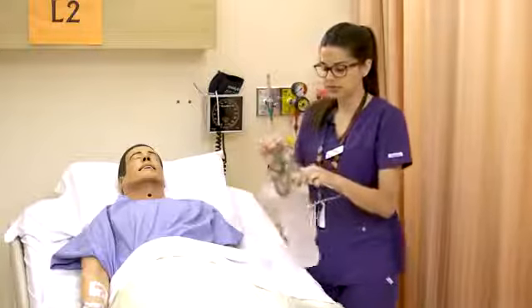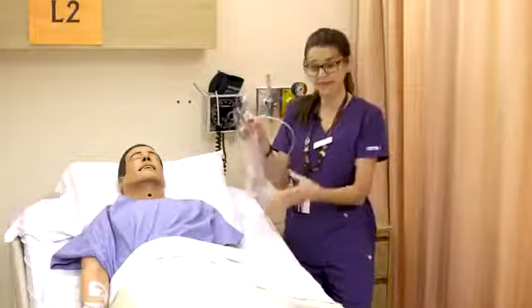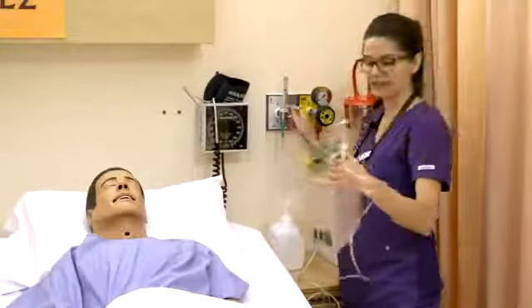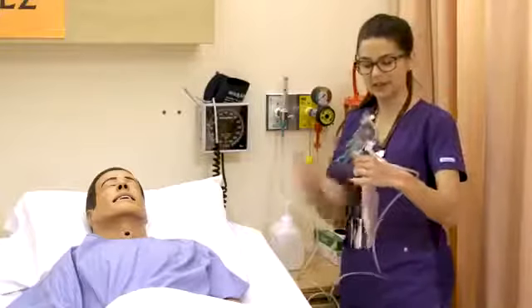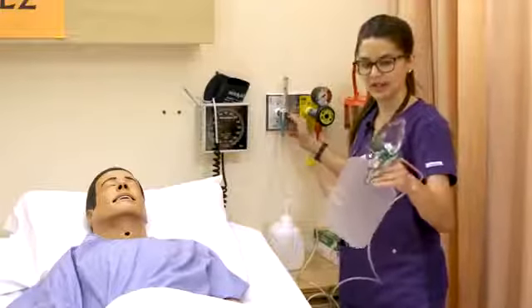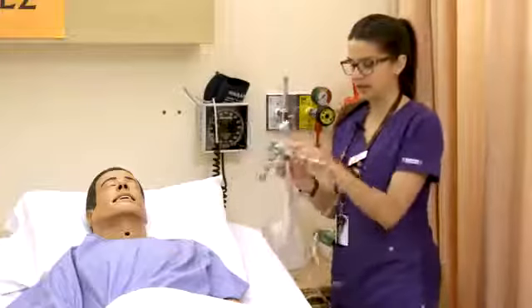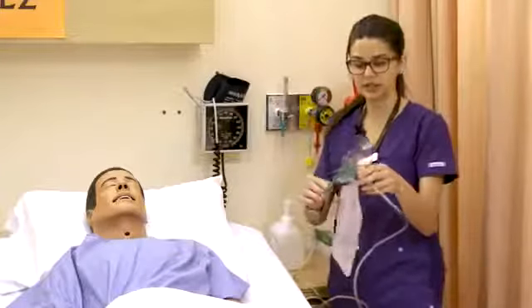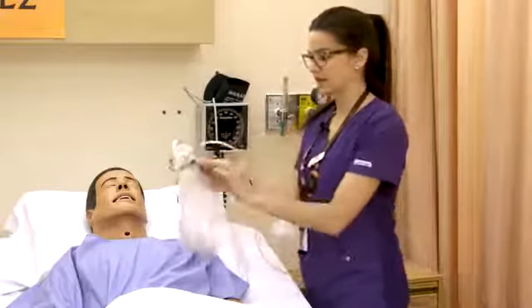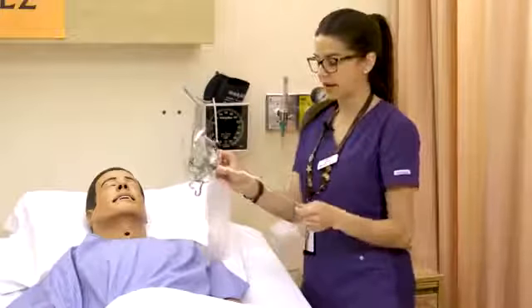What rebreathe refers to is that the person is able to rebreathe some of their exhaled air. So you'll want to turn on your oxygen, and you'll want the reservoir bag to fill. Ours doesn't dramatically fill because of the force of oxygen, but in a facility it would fill a lot faster. So this reservoir bag is what's going to deliver that oxygen to the patient. But with that rebreathe function, they're going to exhale some air into this bag that they will then rebreathe.